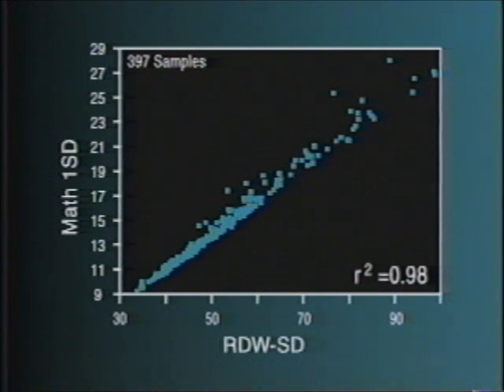The R-squared for that was 0.98, and you can see visually that there is almost a straight line. We also calculated the results for just the patients that had a normal MCV and those that were macrocytic or microcytic. You really wouldn't expect those R values to change since they were so good to begin with for the whole population, and they didn't. They were the same.